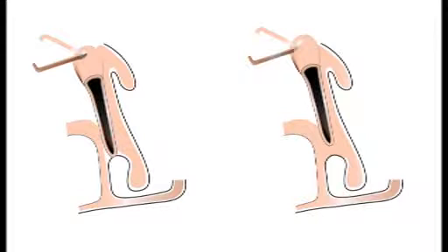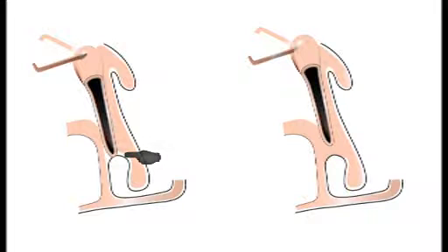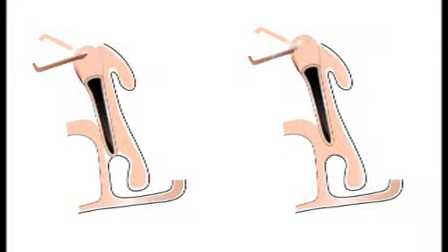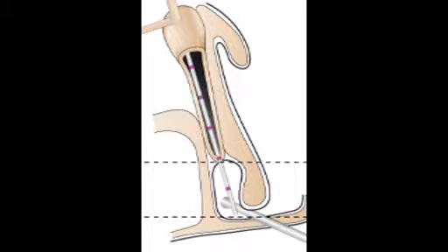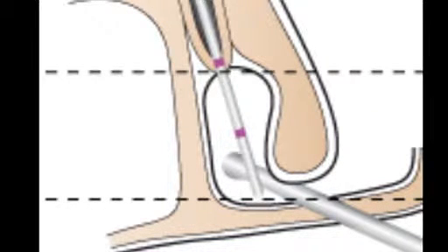Tactile sensations felt during the exploratory probing permit the surgeon to distinguish between simple nasal lacrimal duct stenosis and more complex obstructions, thereby allowing the surgeon to assess whether the Master Ka stent system is appropriate for the specific patient. A larger lacrimal probe with a blunt tip is advanced very carefully beneath the inferior turbinate, searching for metal-to-metal contact in order to confirm proper location of the Master Ka stent.